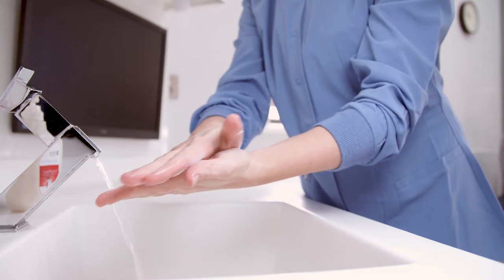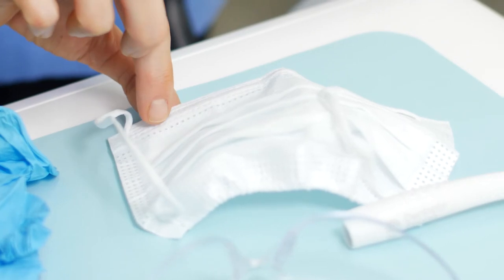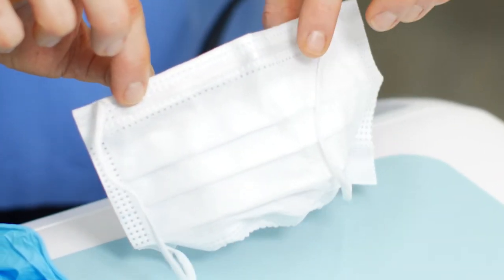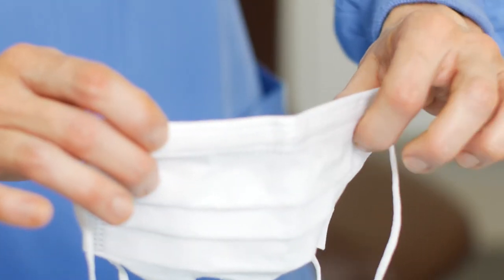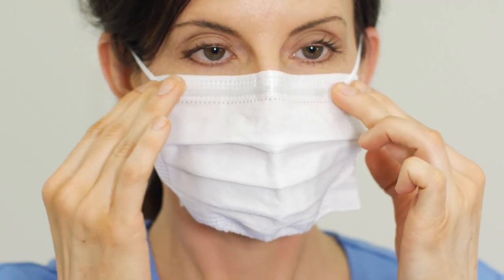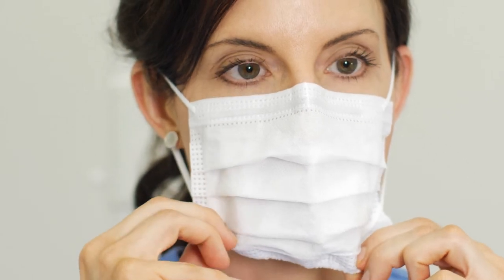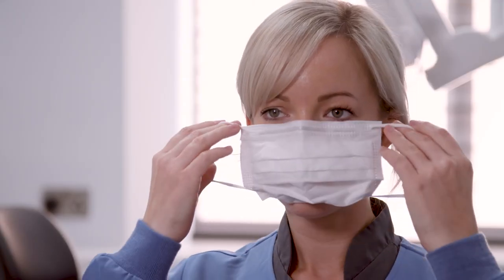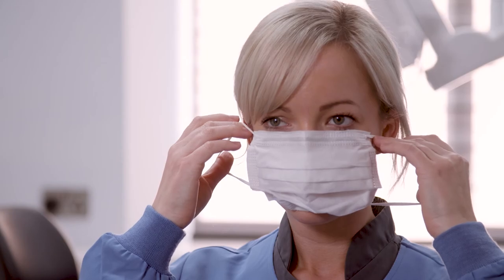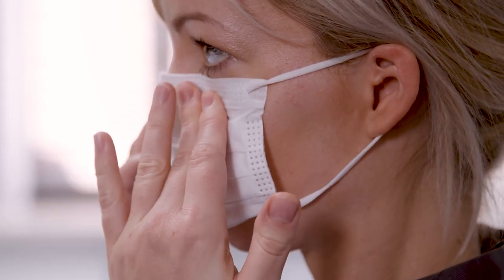Prior to donning a face mask, perform hand hygiene. Orient the mask for proper placement. Pleats should always be facing downward. The patented nose band is pre-bent to the contour of the nose to help with placement. Holding the mask by the ear loops, place loops around each ear. Pull the top and base of the mask over mouth and chin.